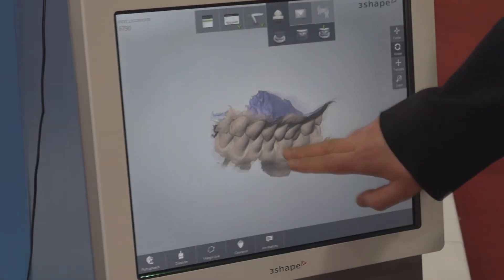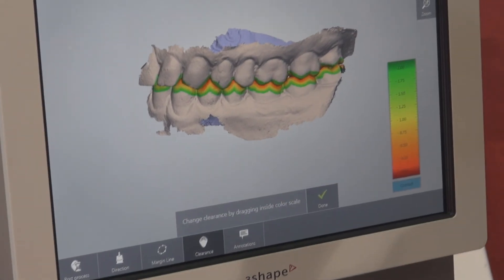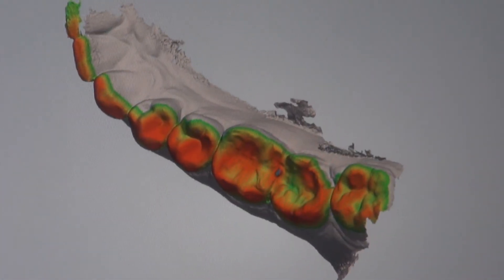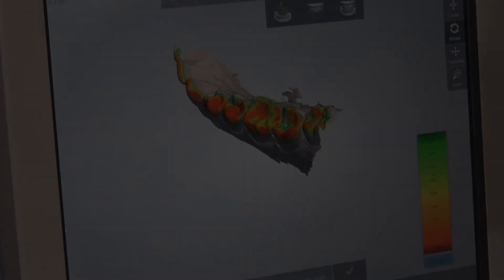The next stage will be to validate our scan. We can check the clearance, so how much occlusion we have for our restoration. Since I don't have a preparation in here, I can show you just a pretty tight occlusion. We have this gauge — it's adjustable — so we can see quite clearly how much space there is in occlusion in certain places.